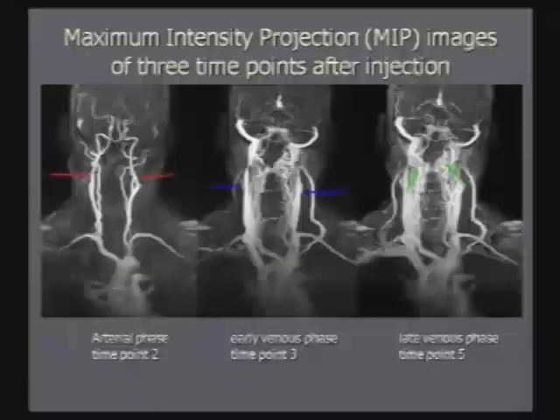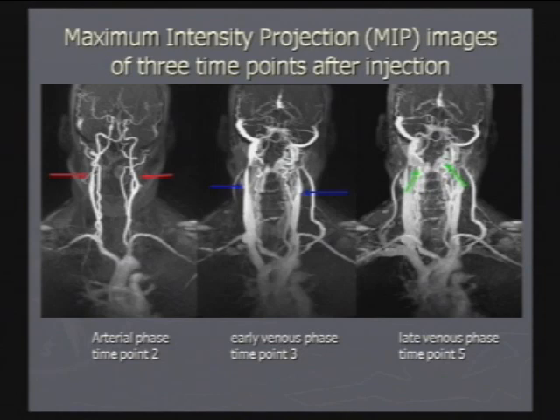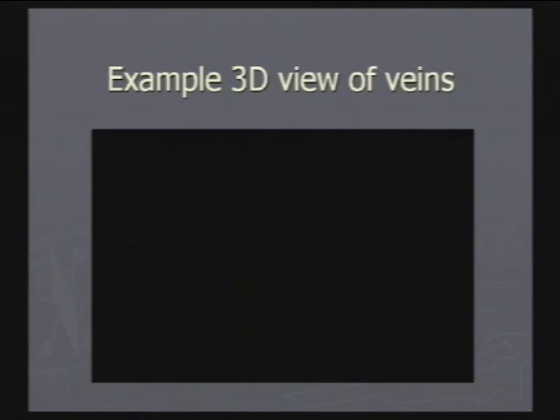Now you can see the image gets very complicated later on after about a minute and 15 seconds, but here you can begin to see the vertebral plexus very clearly. There's more contrast agent that's made its way into the very slowly moving vessels, and so there's lots of information available to us here, both in time and in space. Sal showed that one already, so I'll move on.